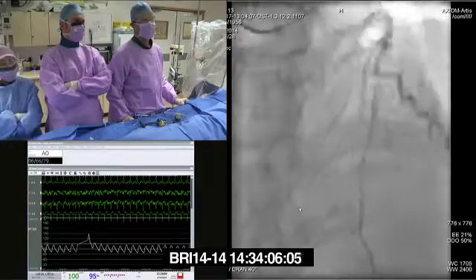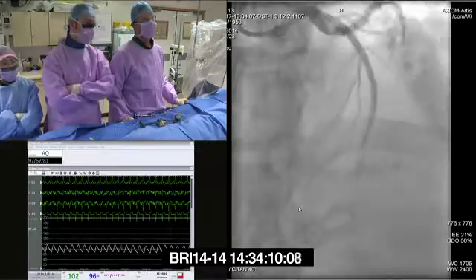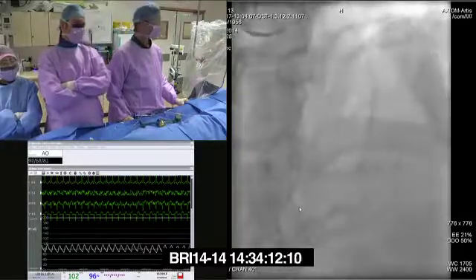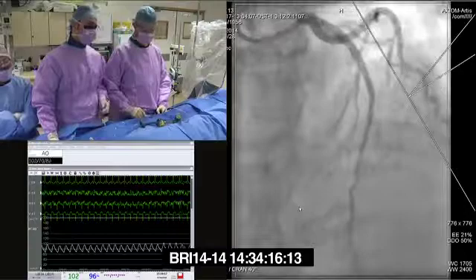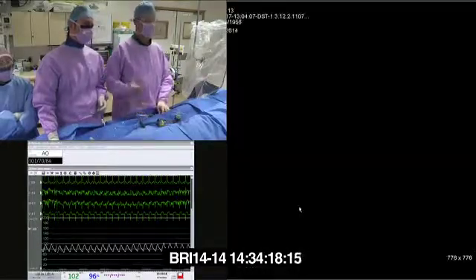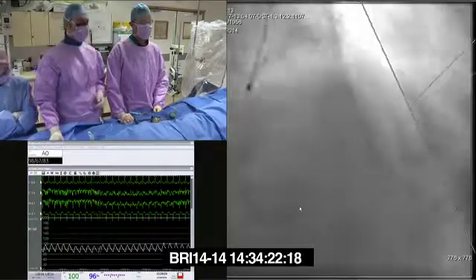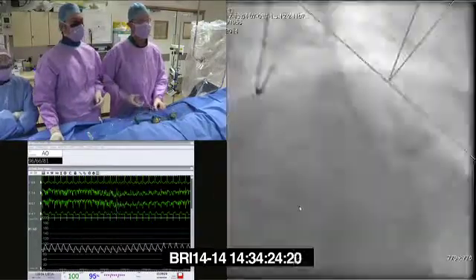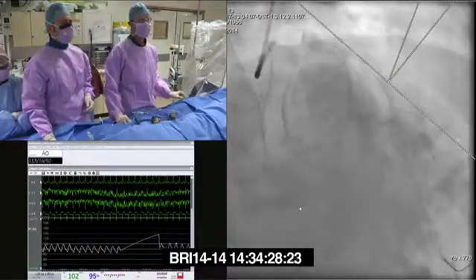Post dilate the proximal, obviously up, and then it's just whether we take a 3.0 short and what we do with that. Just come to an AP cranial view. Do you think that the distal will pick up later? I think it goes intramyocardial, just the way it feels. I'd explain the pathology a bit, although it doesn't look as though it dives down there, does it?